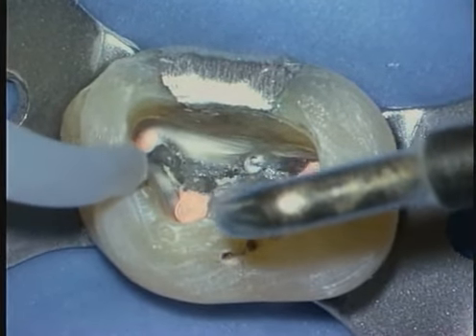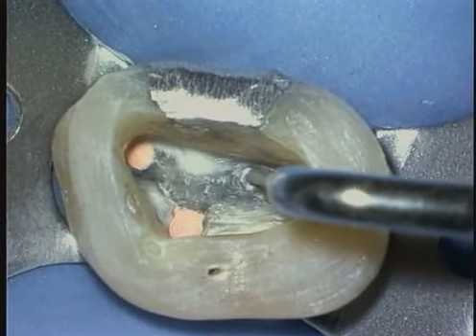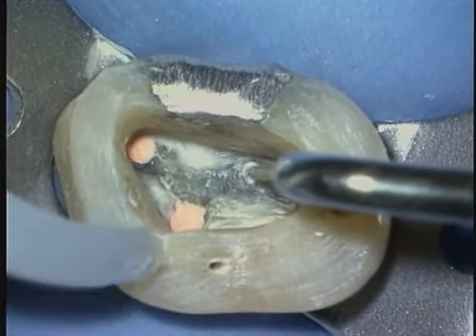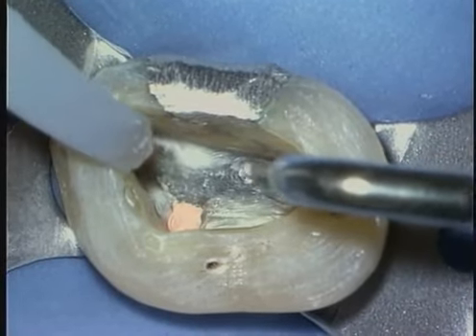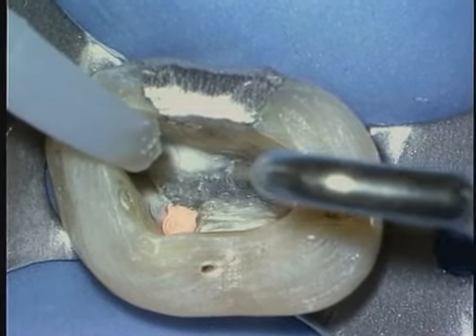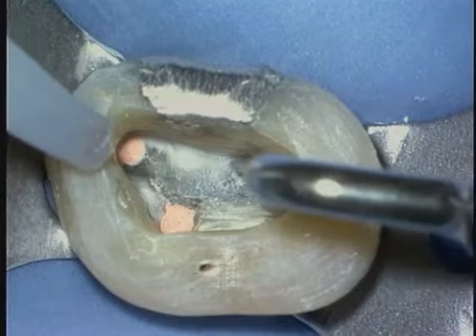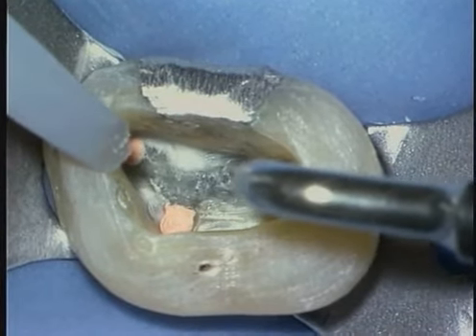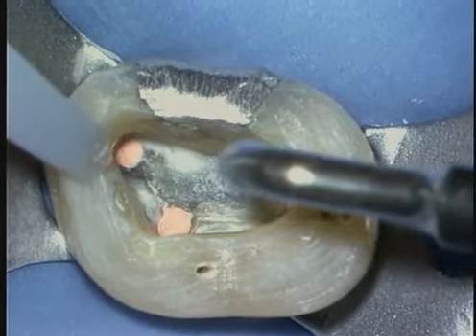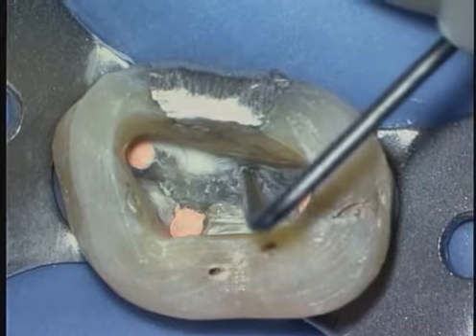Notice the color distinctions between the pulpal floor and the axial walls. A very small, progressively less tapered instrument like an Endo 4 can be used. Notice its small profile gives us incredible control and vision when minutely and discreetly brush cutting away material. Air blows out the debris and gives the operator continuous vision.